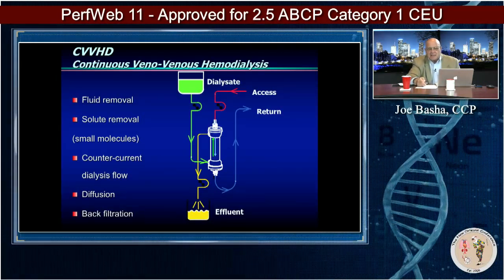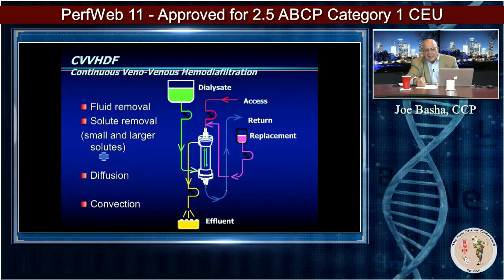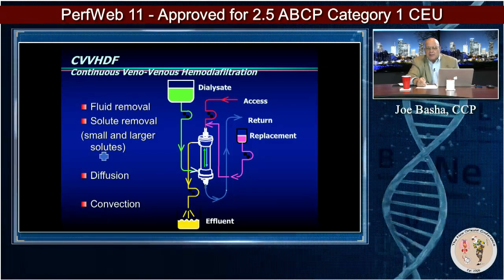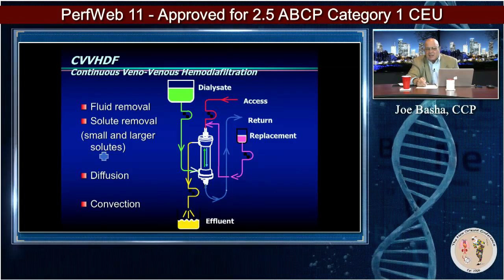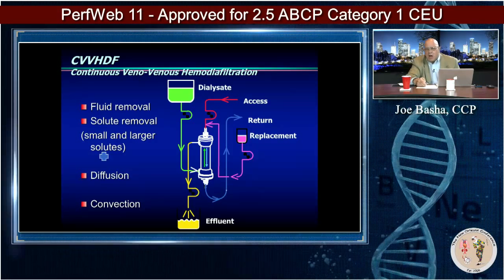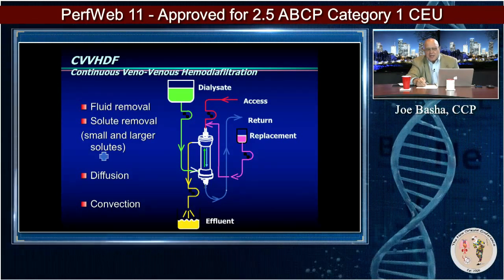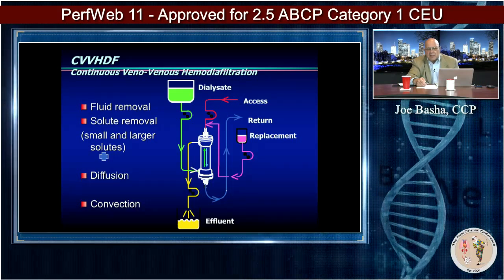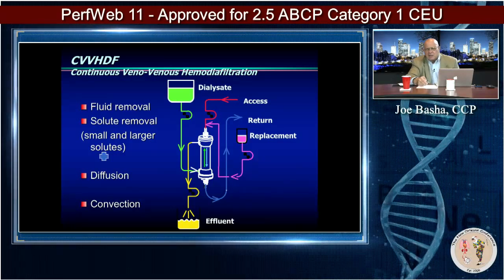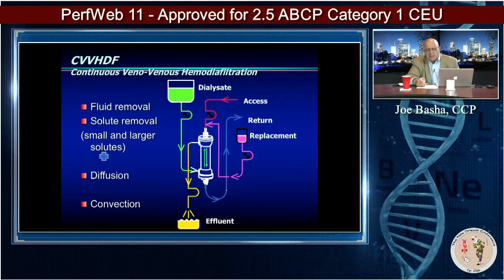Here we have CVVHD. We talked about that already. I think it's pointless. I don't know why anybody does it. And then you have CVVHDF. And I believe the only thing that CVVHDF is actually good for is using all of the pumps and fluids that are available in the circuit to increase the amount of therapy by milliliters per kilogram per hour. And I'll talk about how that works as we go forward, because you're using all of the pumps.